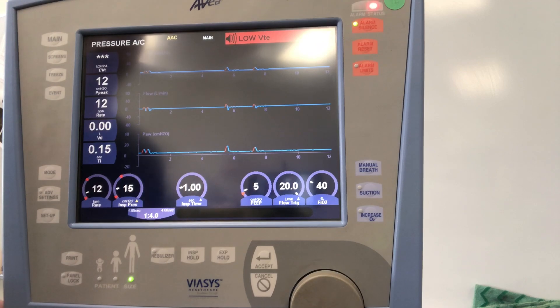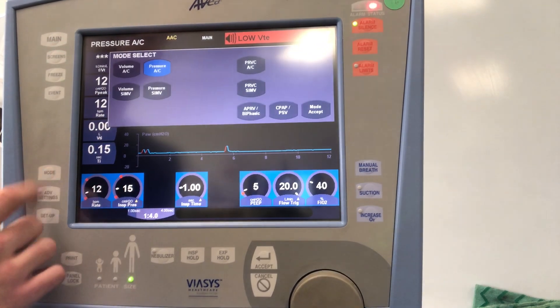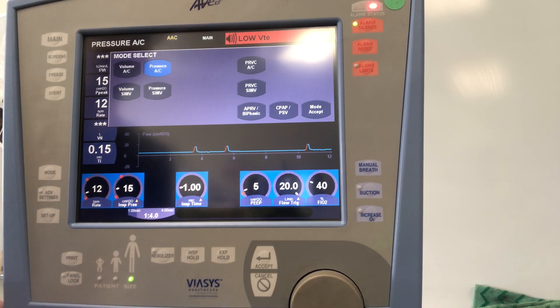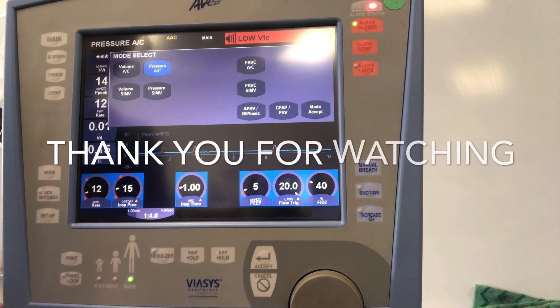That basically covers all the navigation on the Avea. There are some little quirks here and there that you'll find as you use it. If you have any questions, please reach out to your clinical personnel who will be training you with onboarding on this device.